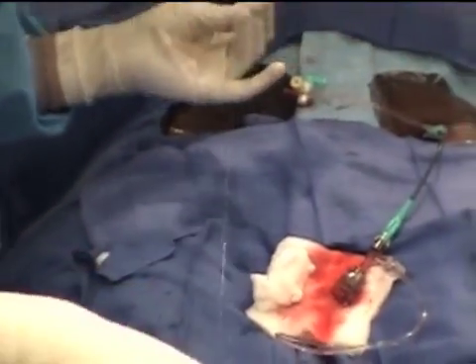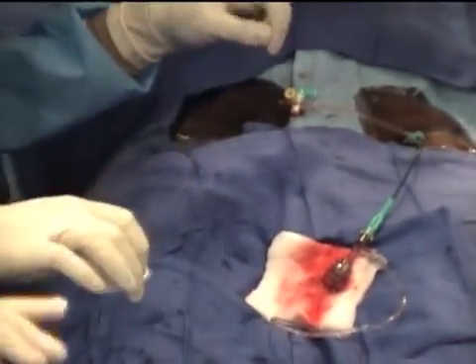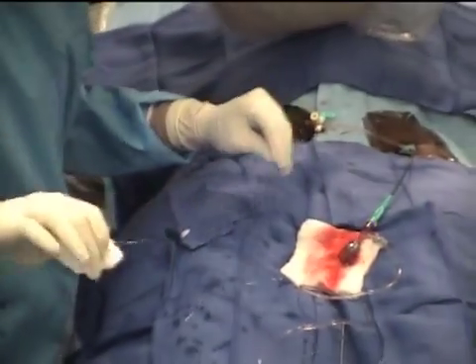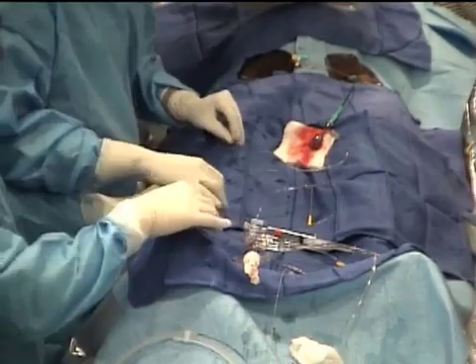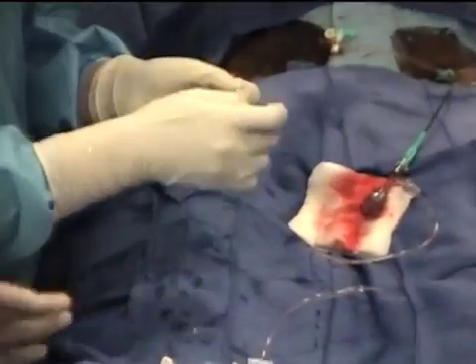out. You have to be very careful, because this is the time when you can cause any kind of bend in this wire. You cannot have any bend, otherwise your rotabur will not advance. Just take it out with a nice smooth movement to clean it, and you can make 3 loops to keep it, and at that end you just make a curve at the tip, and this is ready for us to wire it now.